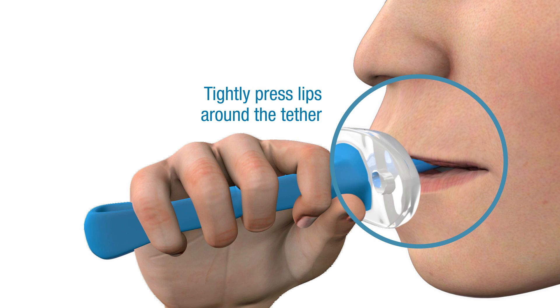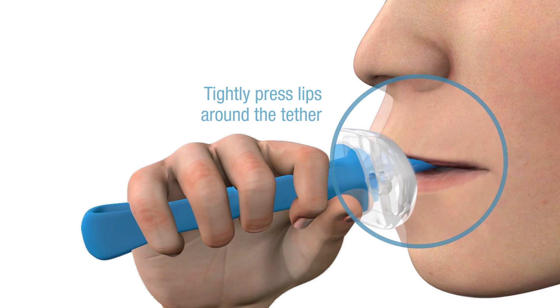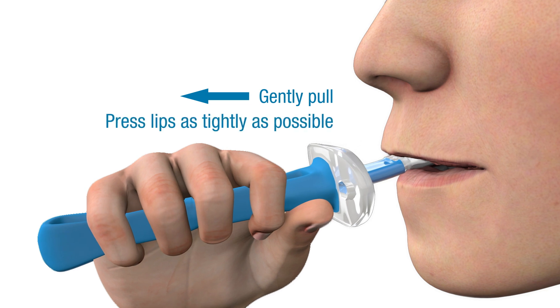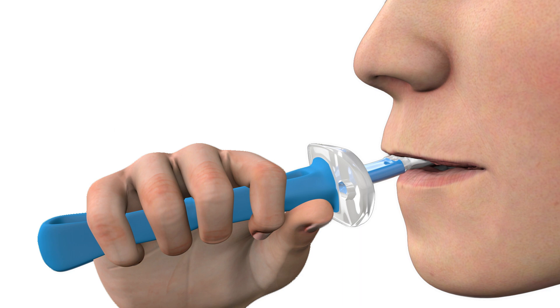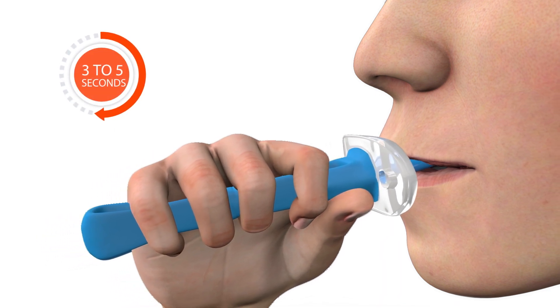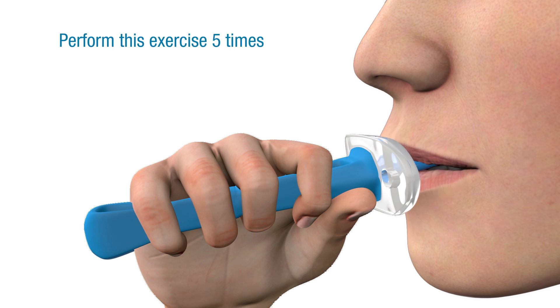Once the tether and bulb are comfortably in position, gently pull the Ablex handle while pressing your lips as tightly as possible to hold the bulb in your mouth. Pull for three to five seconds, then relax your mouth to a comfortable resting position. Repeat this exercise for a total of five times.